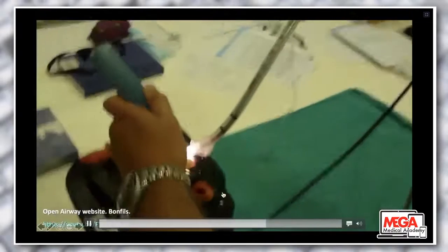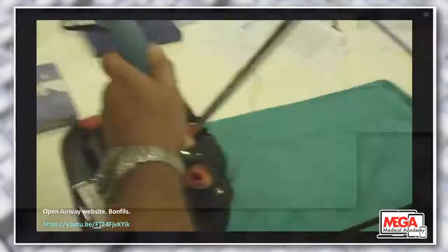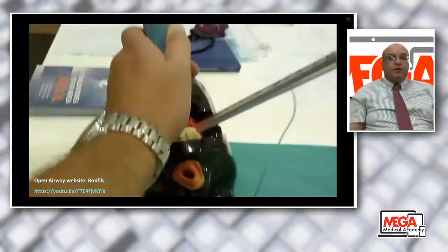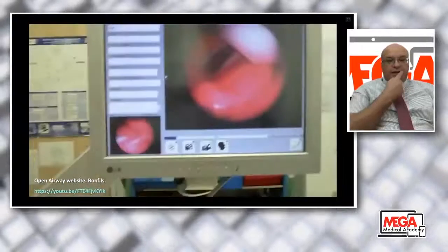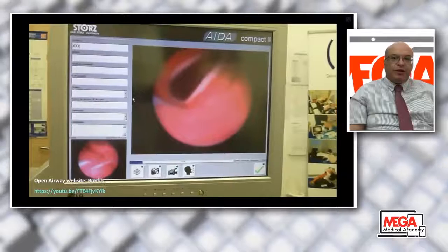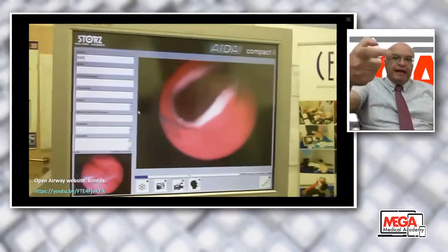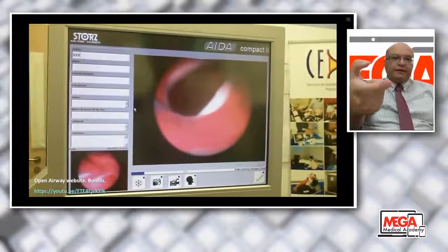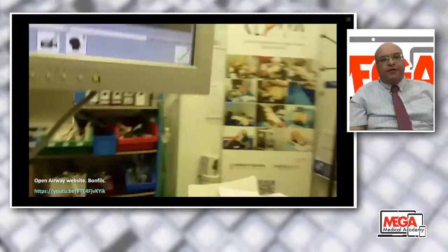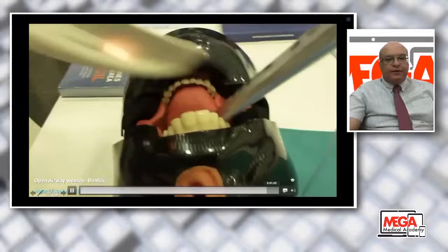And then you have to use a traditional direct laryngoscope just to remove the tongue away from your pathway and introduce the Bonfils with the tube loaded over it. Alongside the right side of the palate, behind the molar teeth, this is called the Bonfils retromolar approach. You start angulated to the left side until you find the glottis, then rotate yourself to make the angle angulated forward. And then introduce the tube inside and get your stylet out.